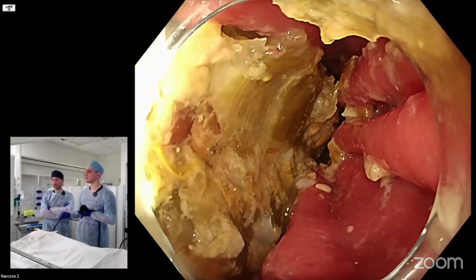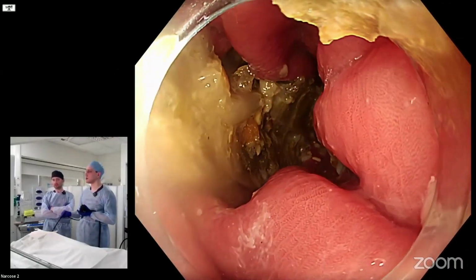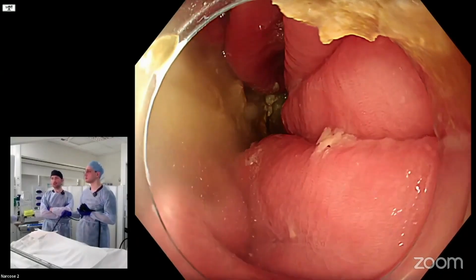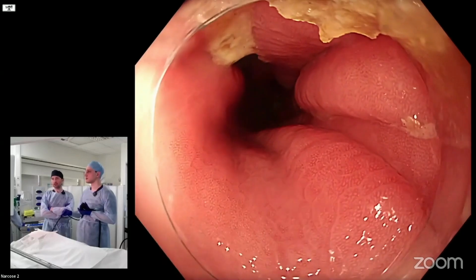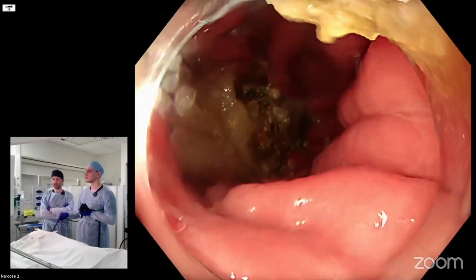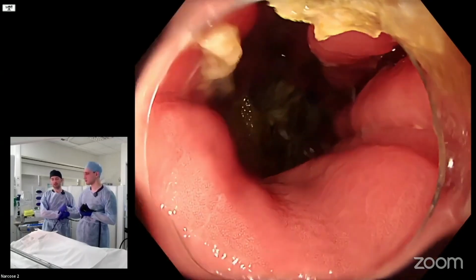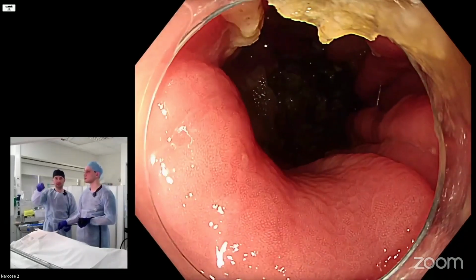So we found a diaphragmatic pinch. We're now going to try to discover the top of the gastric folds, right? So this is the next landmark you need to detect. The diaphragmatic pinch is back in here. Come back in the same orientation. Don't lose the orientation. See this hand? You can relax it a bit more so that you keep it a bit more down here, right? You don't need to have it up in the air because that's quite a lot of stress on your hand.